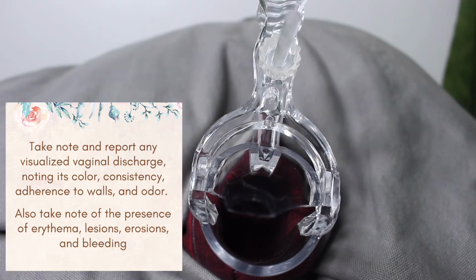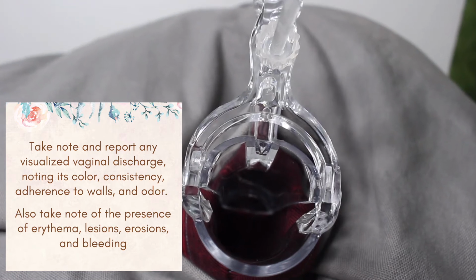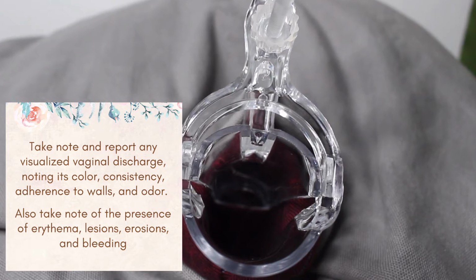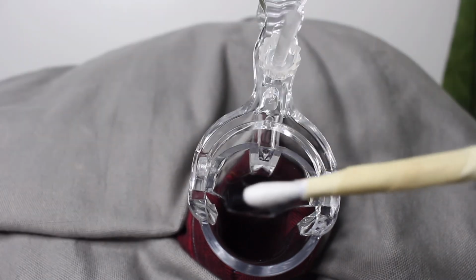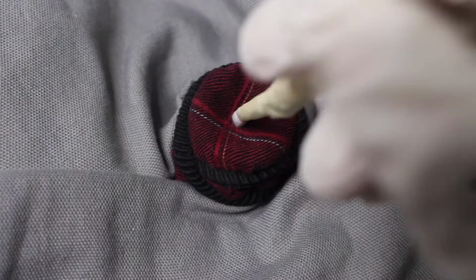Take note and report any visualized vaginal discharge, noting its color, consistency, adherence to walls, and odor. Also take note of the presence of erythema, lesions, erosions, and bleeding. Sample the endocervical canal with a cotton tip applicator or cytobrush, which is placed into the canal and rotated.